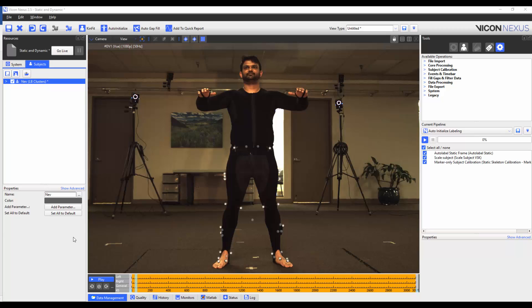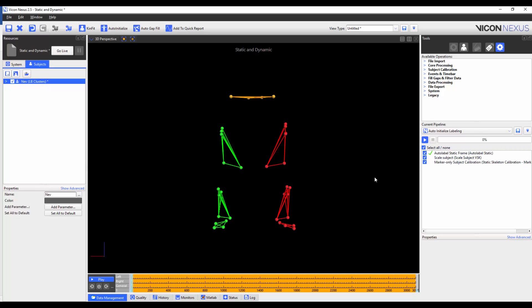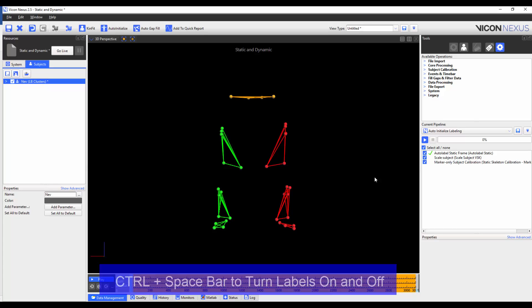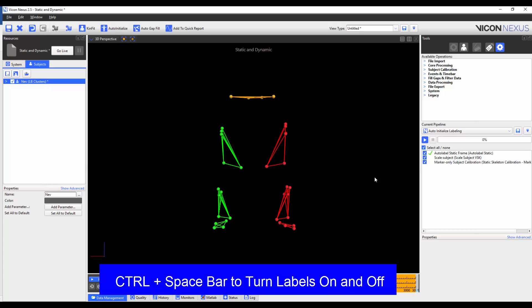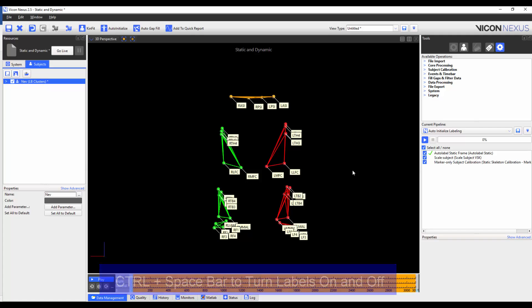I'm going to make sure that I'm on a frame where my subject is standing in the base pose and that all markers are visible. And I'm going to run the auto label static frame pipeline operation first, which will, as the name suggests, automatically label the trial. I'm going to check to see that all markers are properly labeled. If there was anything that was mislabeled, I would fix it.